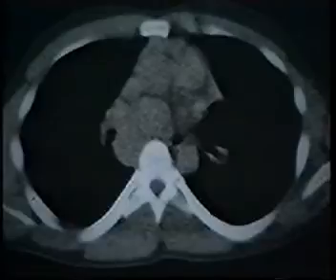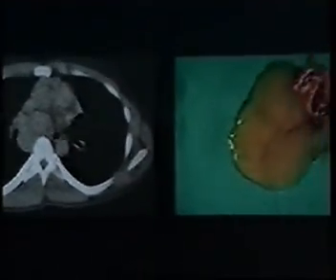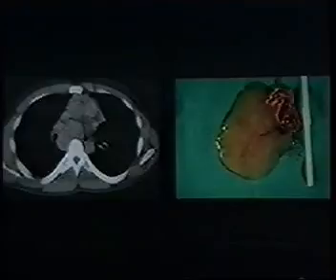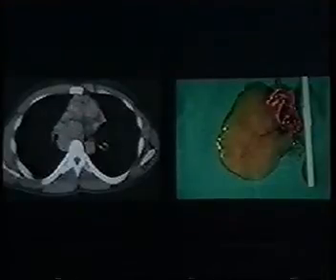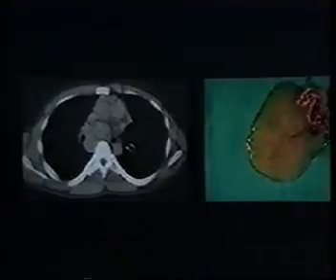These particular lesions can have a wide variety of fluid contents, and the result, therefore, is they can have a wide variety of densities. This is a case that was sent to me from the AFIP by Dr. MacArthur. You can see that there is here also a subcarinal mass, which has the same basic tissue attenuation as the remaining vessels, and you can see why this doesn't have a fluid density on a CT scan, because it's so mucoid, if you will, on a cut section. And in fact, just to go to the extreme, this is the densest bronchogenic cyst that we've ever had. I do believe the ceiling is falling in.